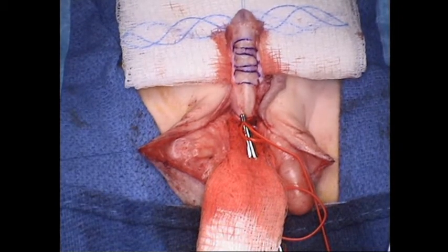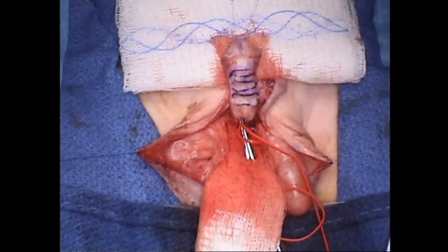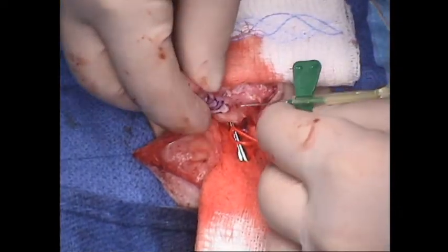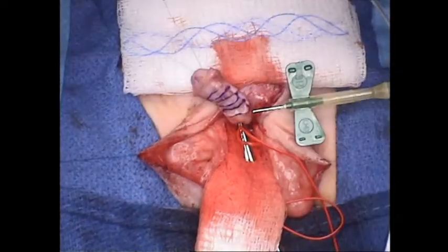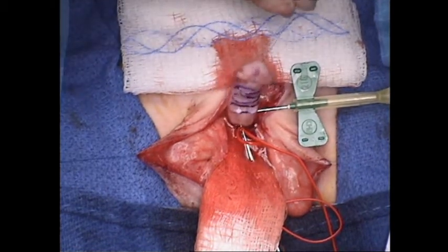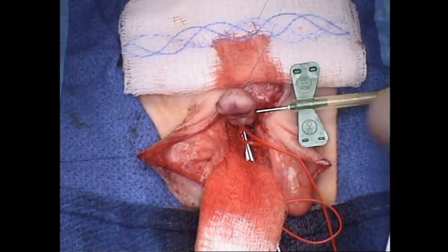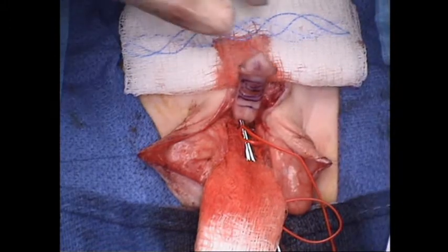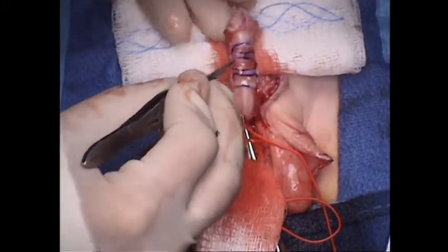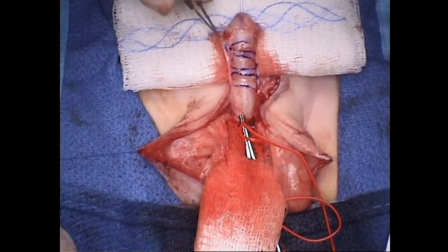And while to an adult-sized penis, a centimeter may not seem like that big of a deal, in these penises that are 3 centimeters, to go from 3 to 4 centimeters is a very big deal in terms of how much length you've gained. Now, once you've done these corporotomies, you can actually repeat an artificial erection. You just have to switch from a 23-gauge needle up to a 21-gauge needle. And those show that we may need to go through just a little bit more laterally. He still had just a tiny bit of bend of the distalmost portion.